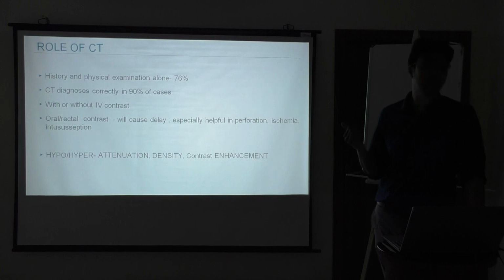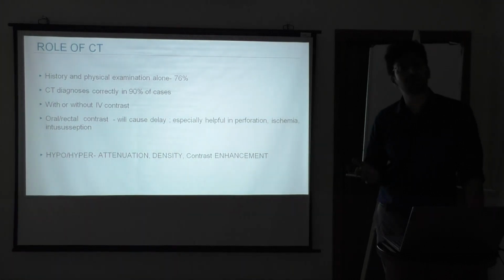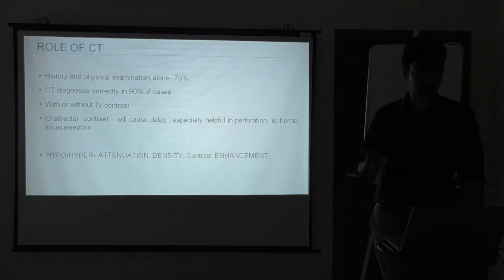But the role of CT mainly is how to approach the patient. Does he need surgery or ICU management, in terms of putting a drain or CBD exploration, ERCP, or in case of aortic aneurysm, CT angiography, what is the next step? This will act as a guideline. So that is the importance of CT.